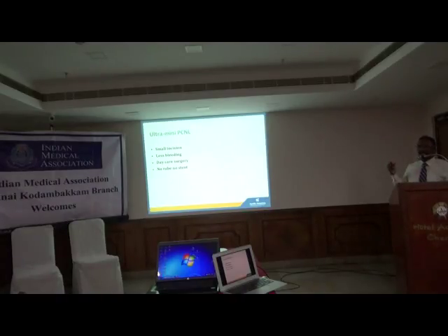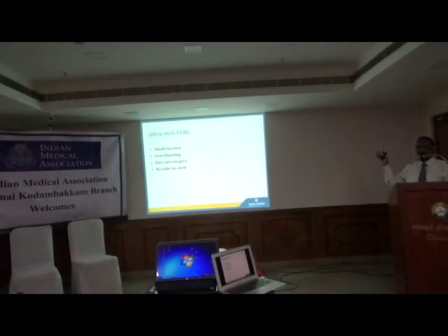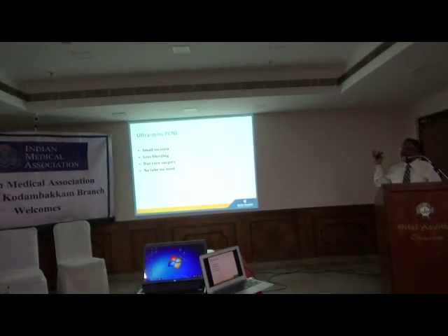The next step they moved to, and I don't have much experience with this, is from mini PCNL to ultra-mini PCNL. Basically, the size of the sheath is being reduced. Finally, with a smaller incision and less bleeding, because of mini PCNL what we have achieved is that we don't admit any patient nowadays. PCNL can be done as a daycare. This is the biggest breakthrough now.